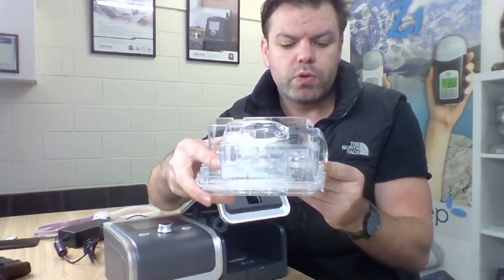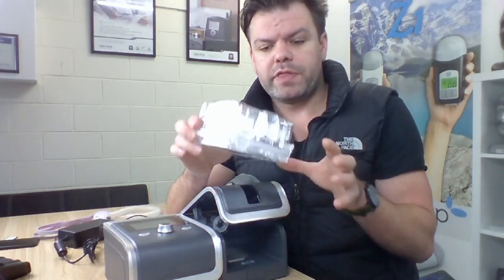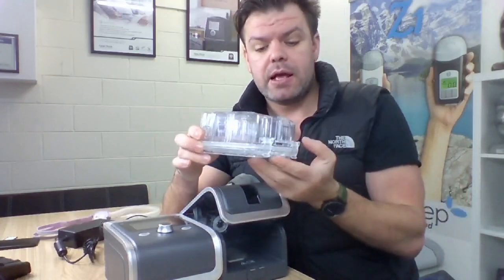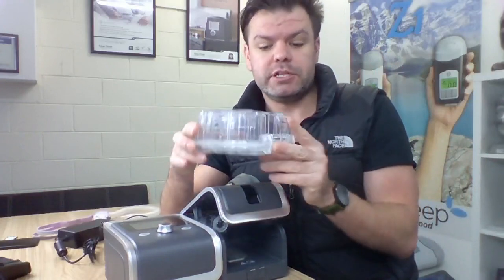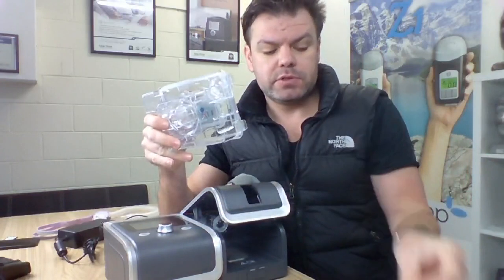It's quite a unique water chamber in the sense that it's actually got two compartments in it, and this middle compartment doesn't actually get water in it. That keeps it water free, and it heats up and creates heat in the air, which is really handy. That way you get moisture and heat in the air, okay? And that's a really cool feature of this machine. I really like that.